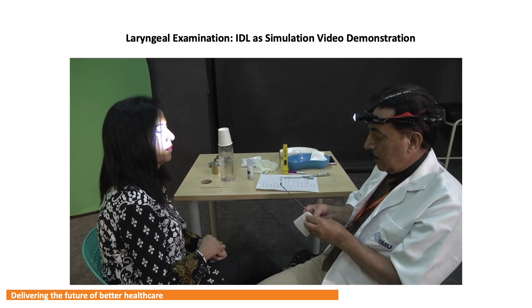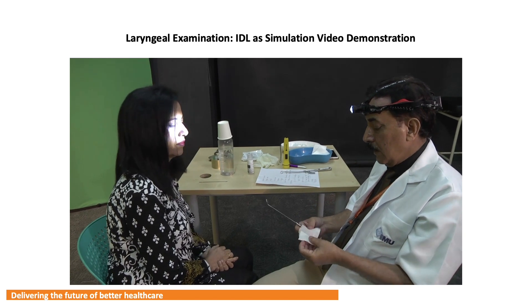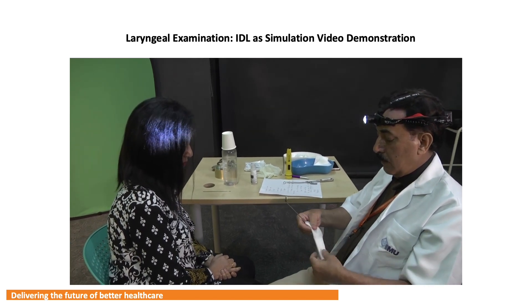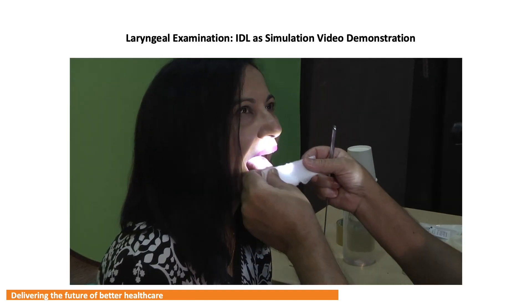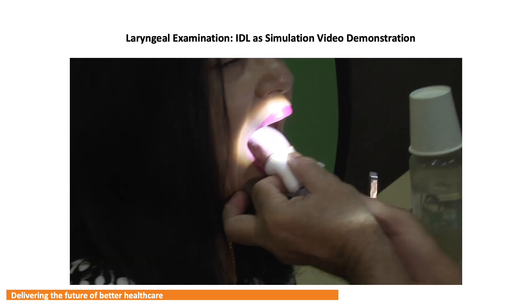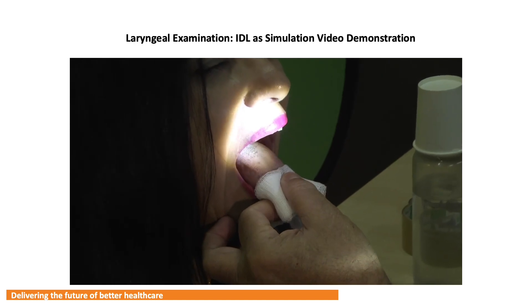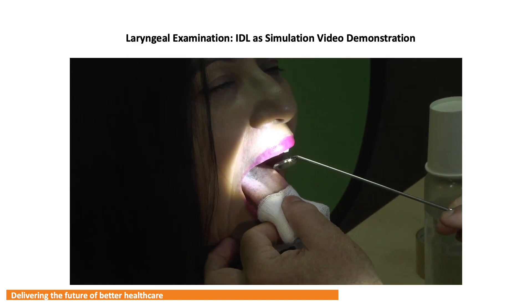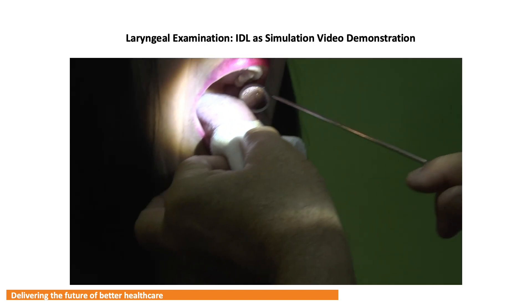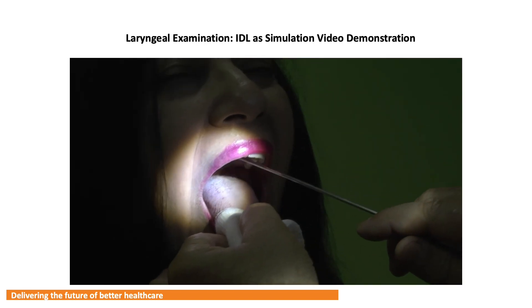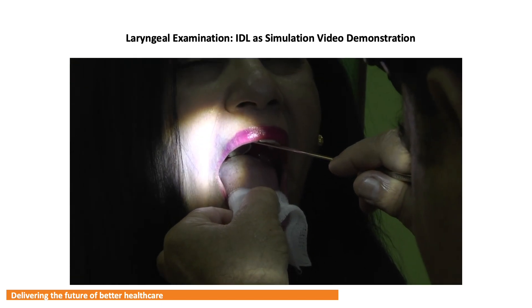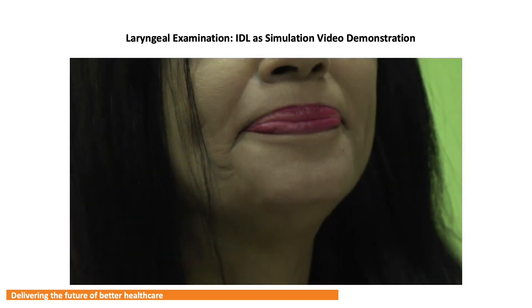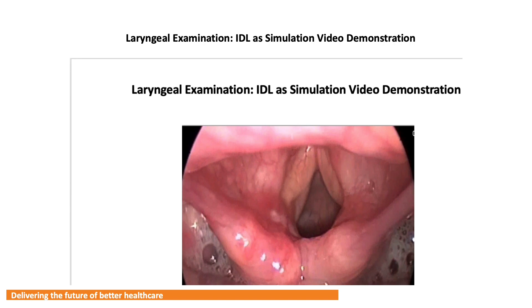Now I will unroll the gauze piece and make it a little thinner. Ask the patient to open their mouth and take their tongue out; we place the gauze over the tongue and hold it. After dipping the mirror in hot water or applying anti-fog, I bring the mirror in from the lateral side, then position it in front of the uvula. The patient is asked to breathe from the mouth, and through this IDL technique we can examine almost six structures of the interior larynx.